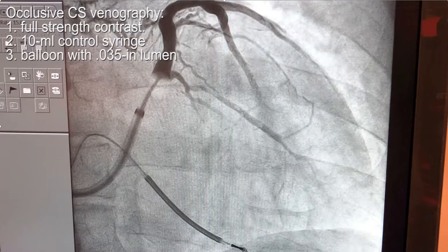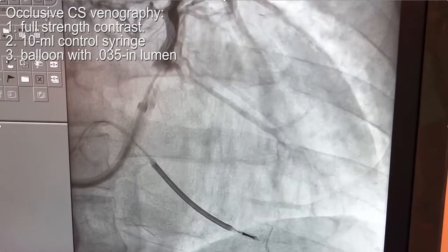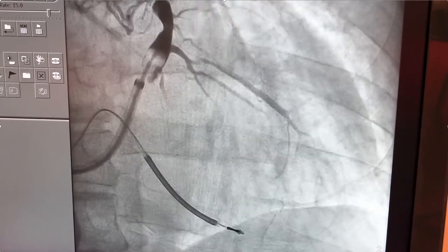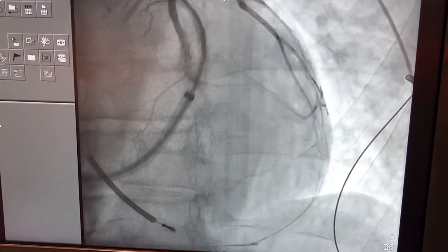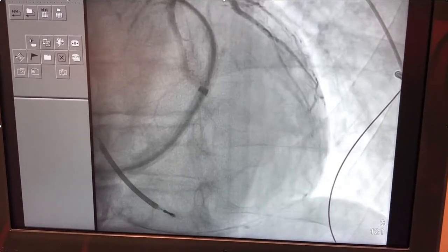Sometimes even an adequate occlusive coronary sinus venogram will miss a lateral wall branch. As you can see here, we have this target branch and we don't really see much else. We're doing a nice distal injection here and we're really only seeing this one branch, but you wonder why there's nothing seen down here.